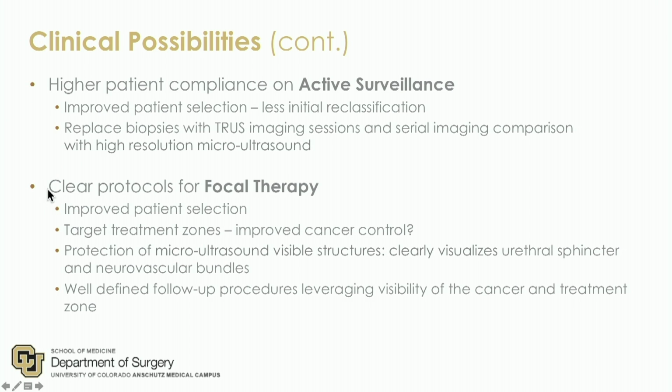So at any rate, focal therapy is something that's out there and something that can be used. And the nice thing about this is that Priya Warahara, myself, and others are working on ways to ablate tissue right away. So if you actually can see it, we can put Priya's optical biopsy needle in there and say, hey, that's cancer, and we put in our electrodes, turn on our AC current. We've got one-stop shopping getting rid of prostate cancer.